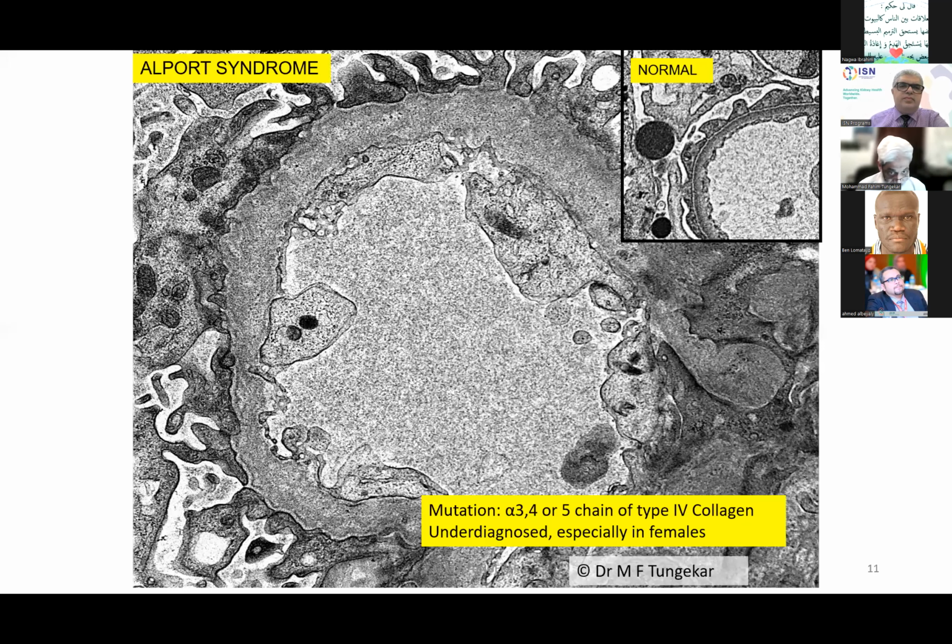We recently had a case who had diabetic nodular glomerulosclerosis, a known case of diabetes, no problem with the diagnosis there, but had crescentic disease as well, with necrotizing crescents, and it was anti-GBM positive. We had 2 cases, anti-GBM positive. Then the other condition commonly seen is IgA, very commonly seen, IgA with diabetic nephropathy. People have also described diabetic nephropathy with thin membrane disease. It's a tricky diagnosis. You have to be very careful in randomly selecting the area of thinness, but that can occur, yes. But it's not an easy one to make.